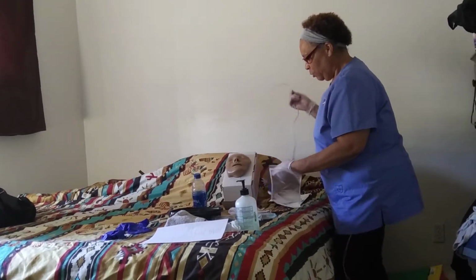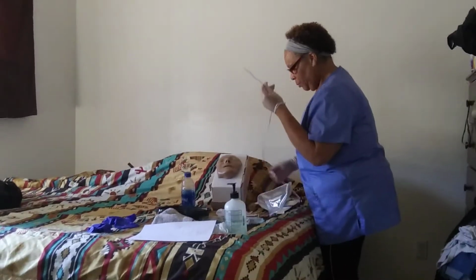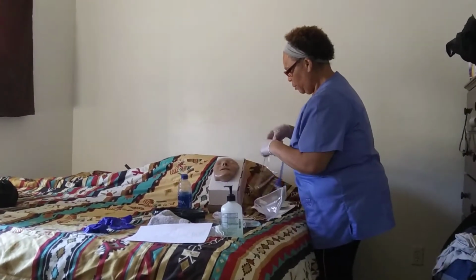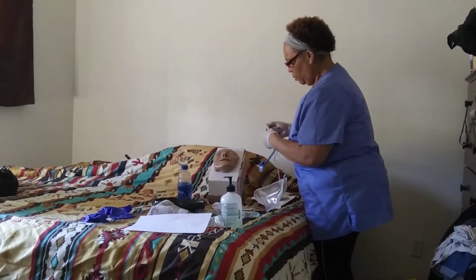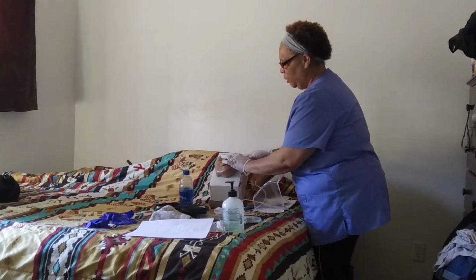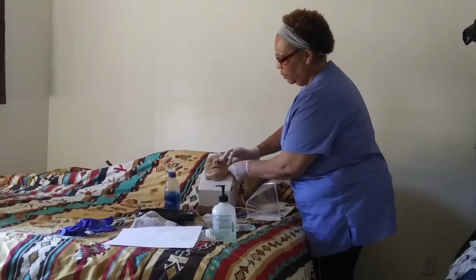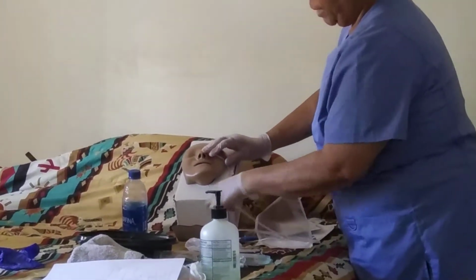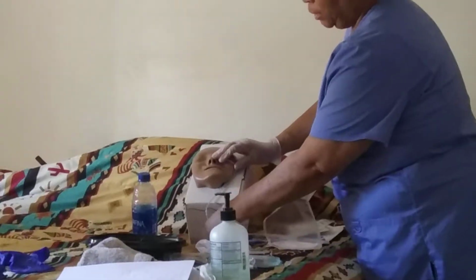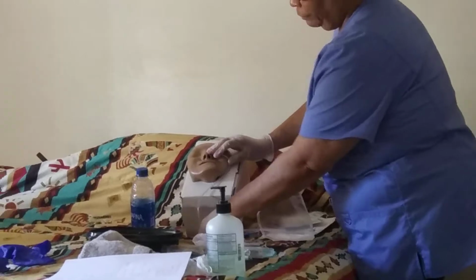I clean up my equipment. And I would take the nasogastric tube and I would measure from the tip of his nose to his earlobe, and then from his earlobe down to the xiphoid process to see how far I would be going down into the stomach region.